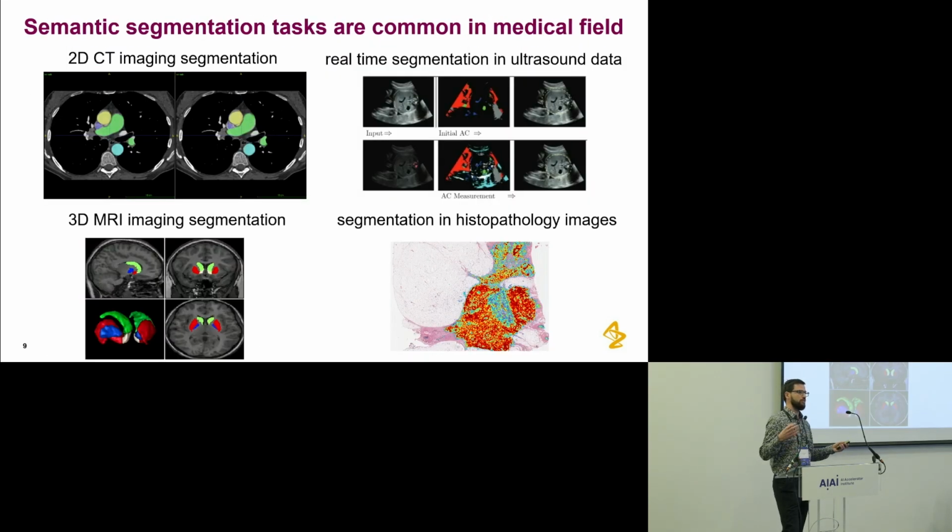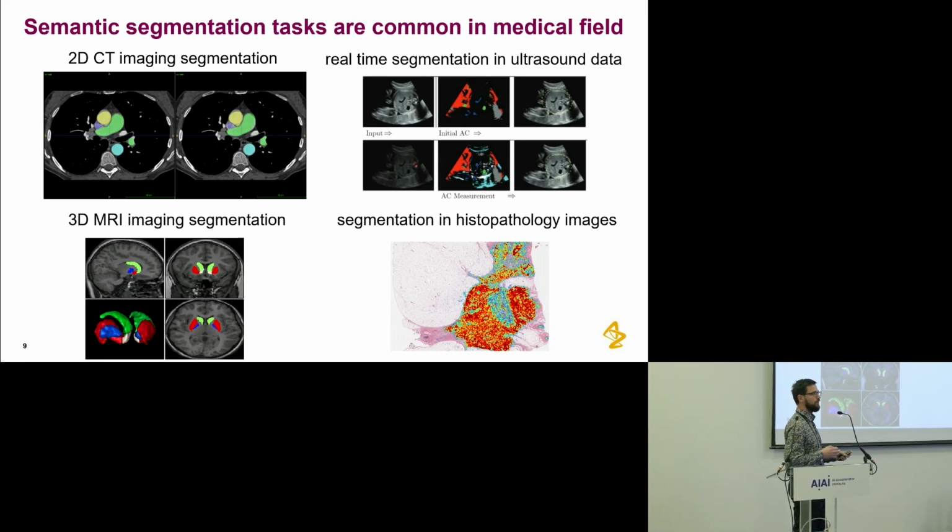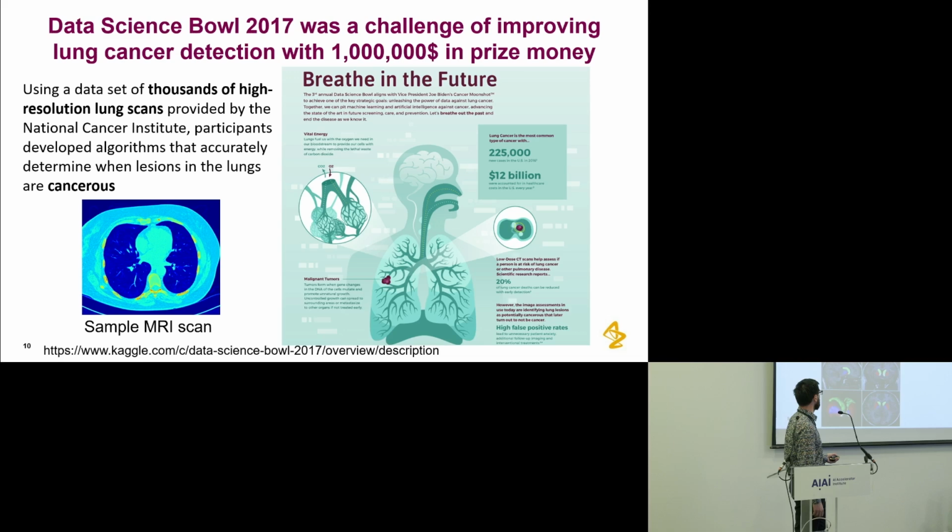Histopathology images are very relevant, for example, for cancer. Let's say a person is suspected to have cancer, then a biopsy is taken, and a pathologist will look at this biopsy and investigate every single cell in it, and for that we need histopathology images.